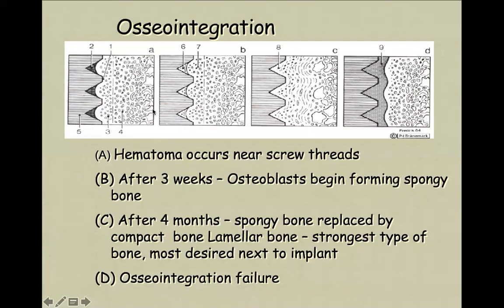But if you did something wrong, if you made a violation of the surgical protocol, like overheating, overloading, usage of improper drills, or your implantation is associated with infection, here we have failure of osseointegration.